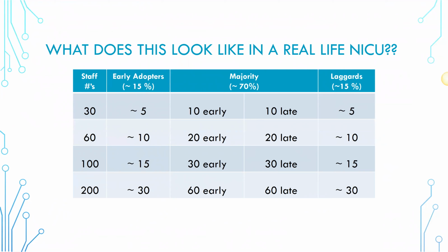So if we put electrodes on, another important decision is to make a decision on how long you'll monitor and when to remove them. I've seen electrodes on babies for 5, 6, 7 days, 8 days, 10 days, and people are like, well, I don't know, no one wrote the order to DC this. So it is important to think about how it's adding value to the patient. It is extra work and maintenance for the bedside nurse.